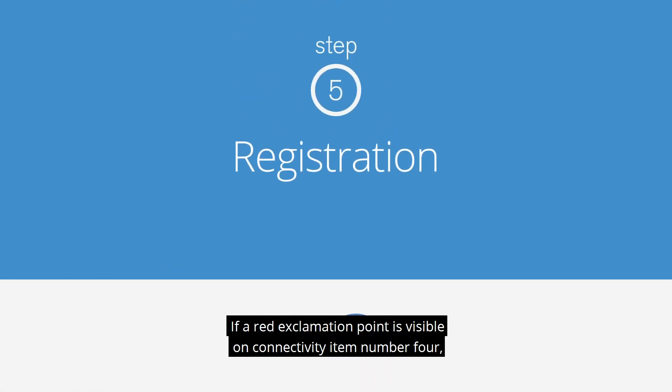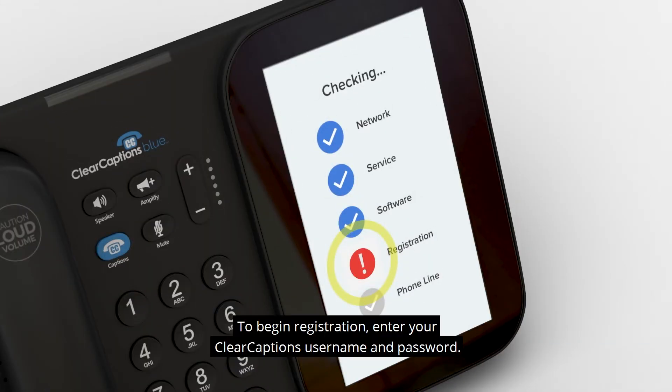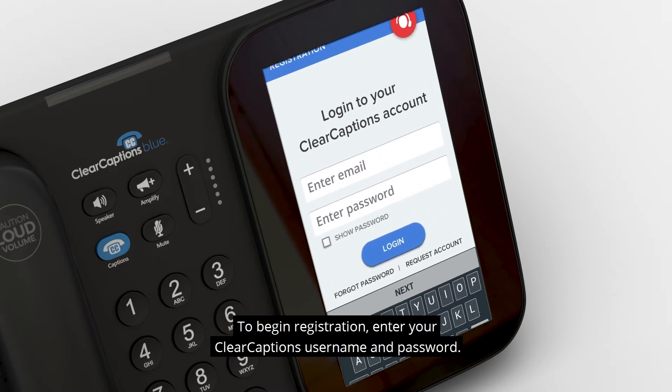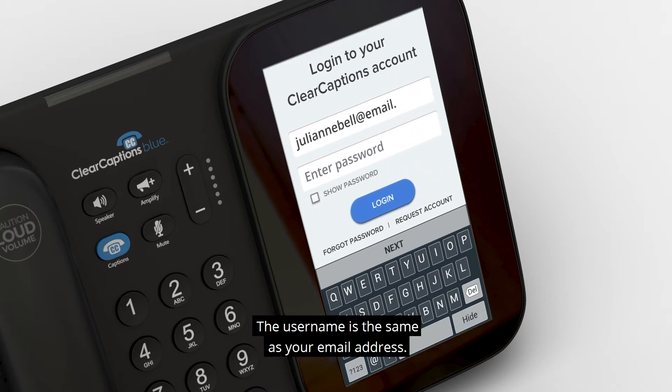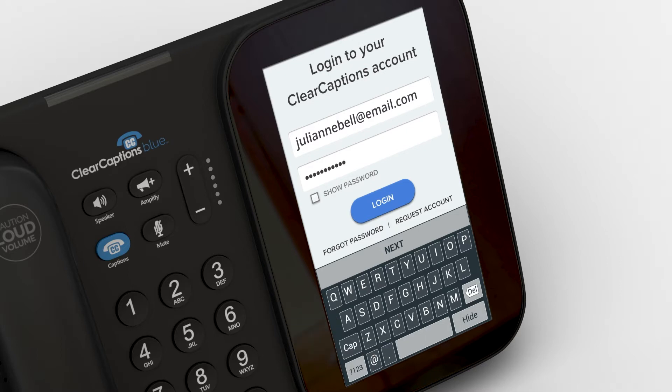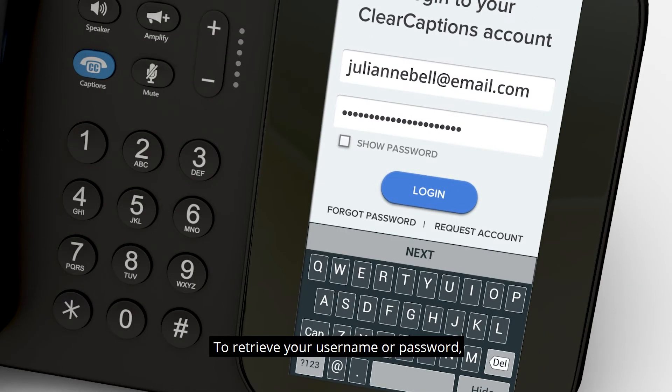If a red exclamation point is visible on connectivity item number 4 — registration — this means your phone has not been registered yet. To begin registration, enter your Clear Captions username and password. The username is the same as your email address. The password was provided to you by your Clear Captions representative. To retrieve your username or password, please contact your Clear Captions representative.